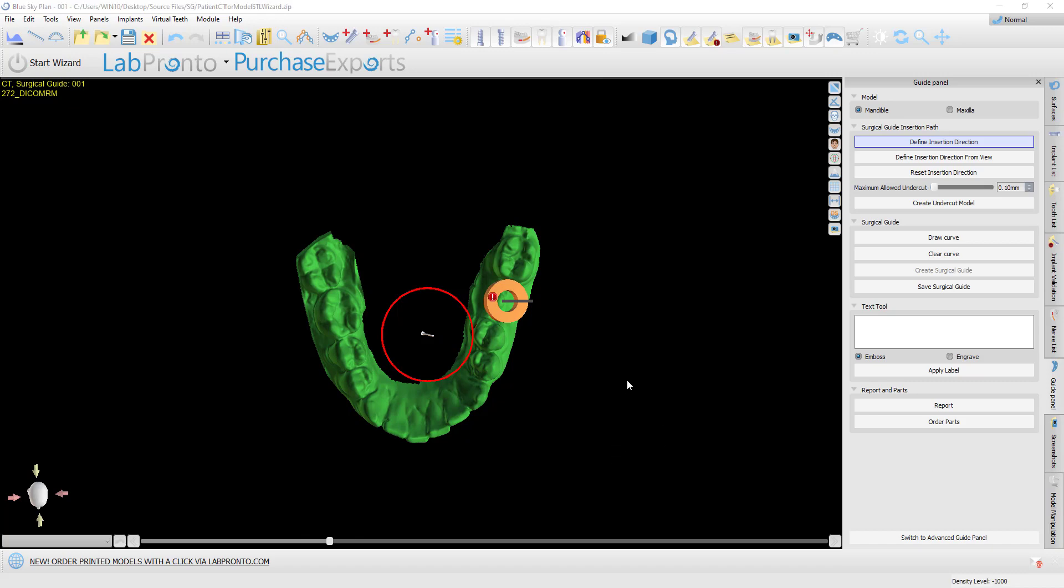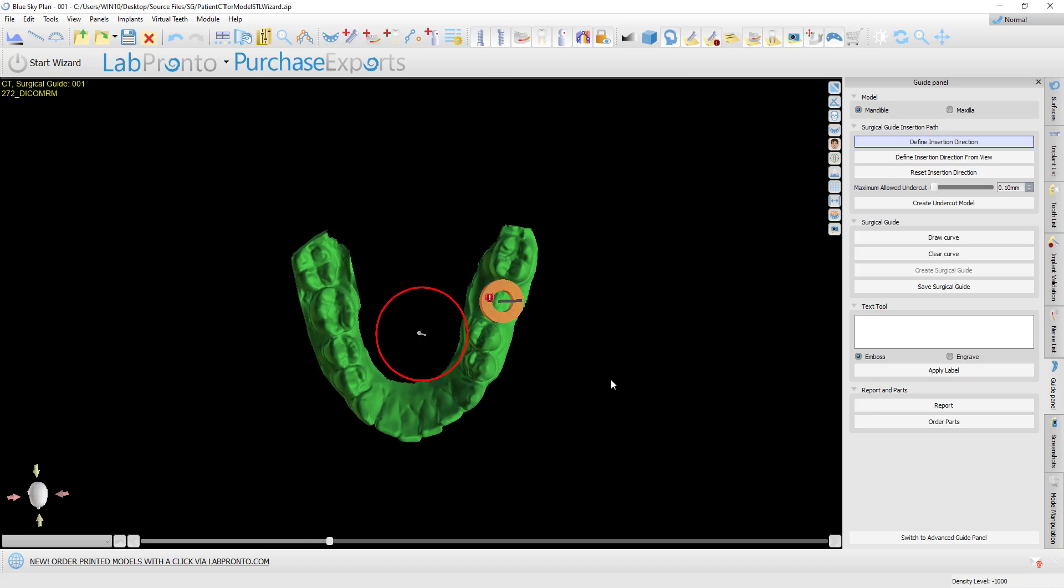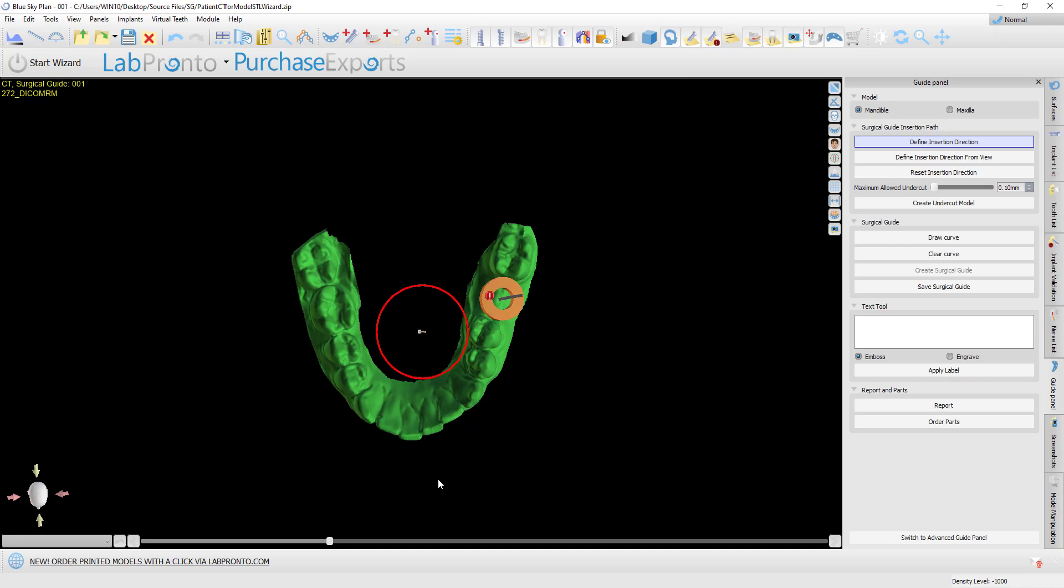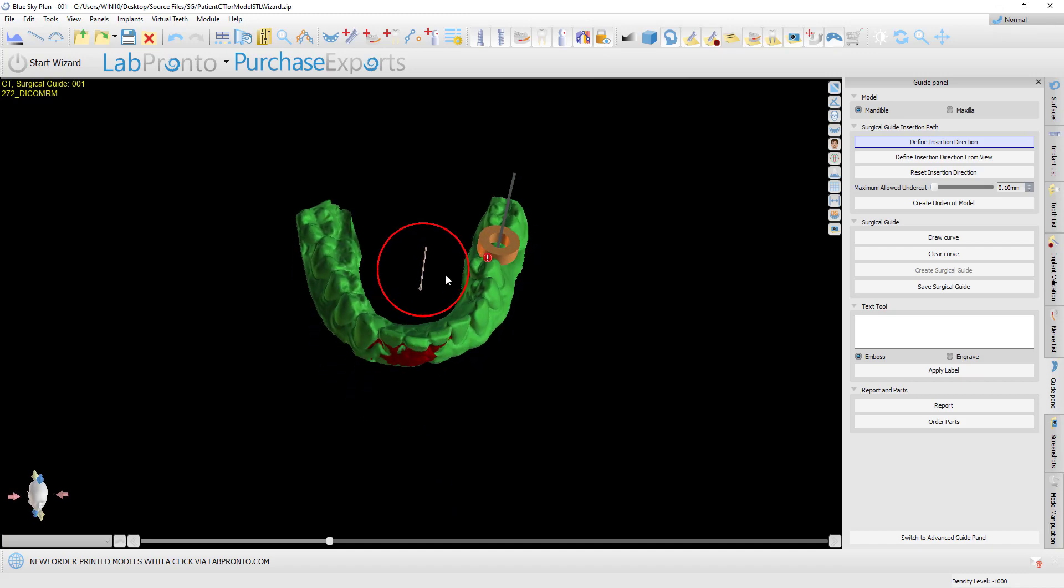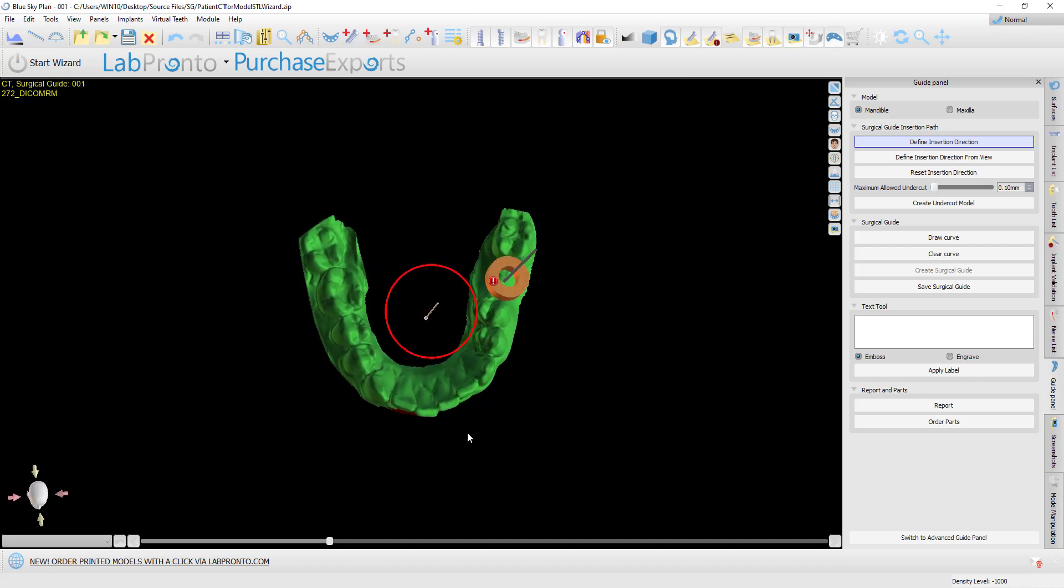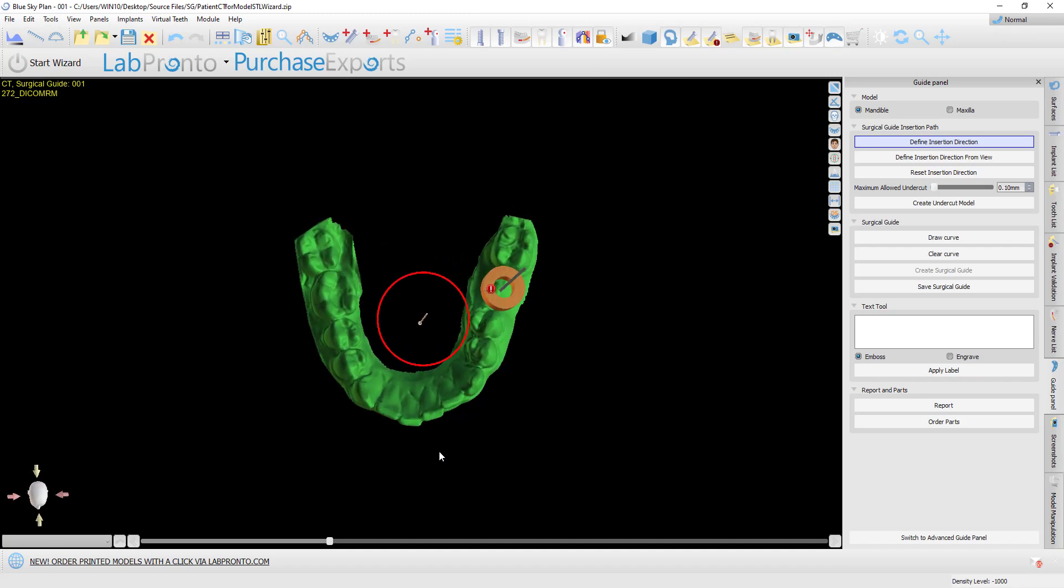Now in this new release, the user in normal or advanced mode can adjust the angle of the insertion path to remove the undercuts.